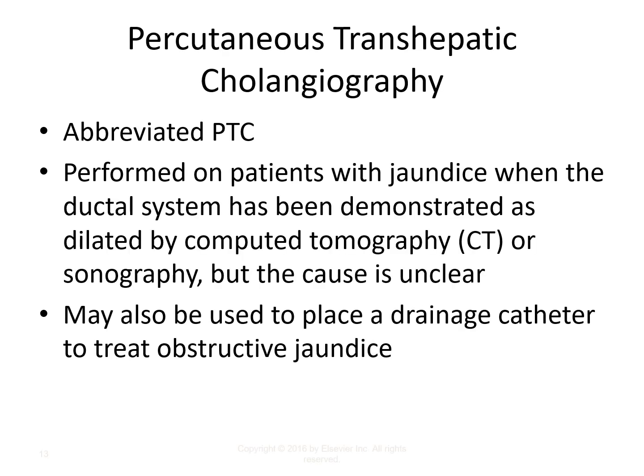So percutaneous transhepatic cholangiography, a lot of times you see this in CT or ultrasound assist, but sometimes you see it in conventional fluoroscopy as well. It's a PTC, and percutaneous means from outside the body or from outside the skin surface.